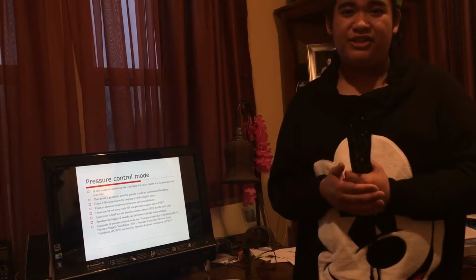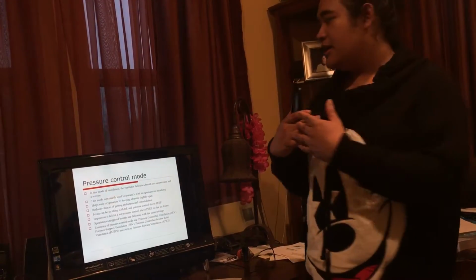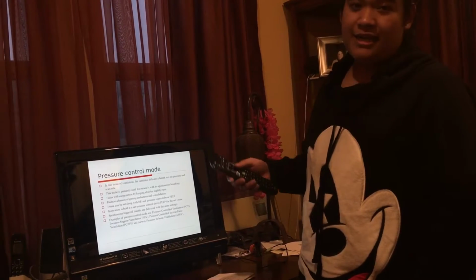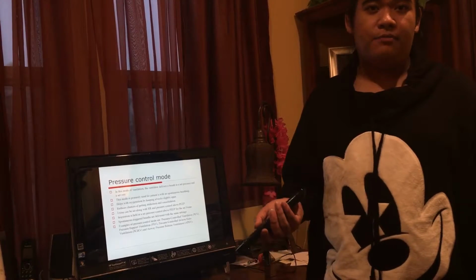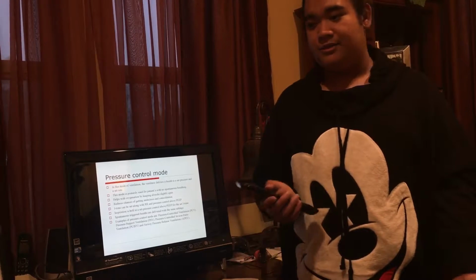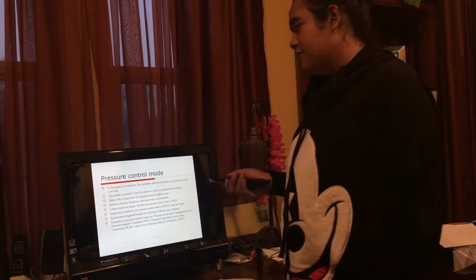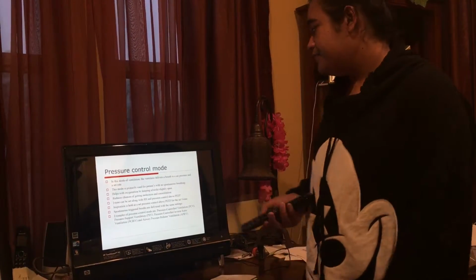One similarity between volume and pressure control is that they both set a rate, with the pressure or volume being set, so the rate is kind of constant for both. Another similarity is that this mode is also for patients who are sedated or can't spontaneously breathe. But that doesn't mean it's only for those patients. It can also be good for patients who can spontaneously breathe or are awake.